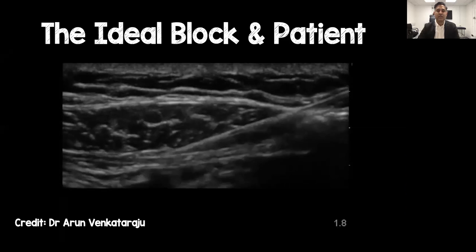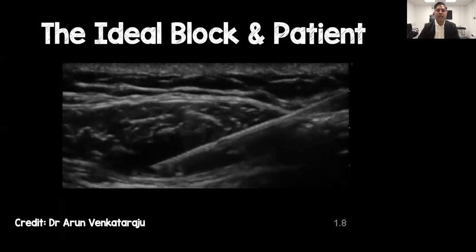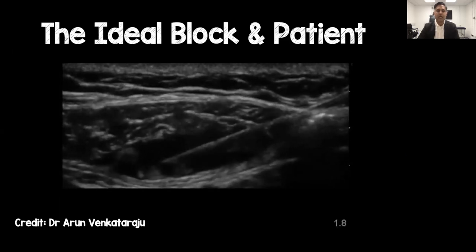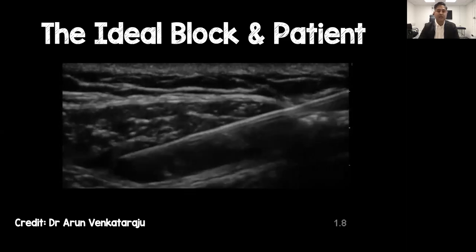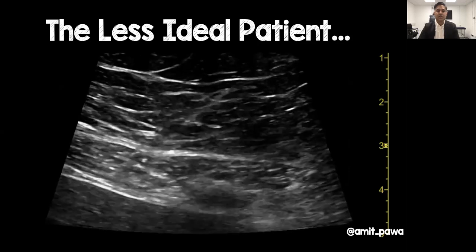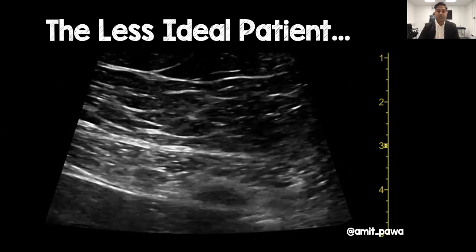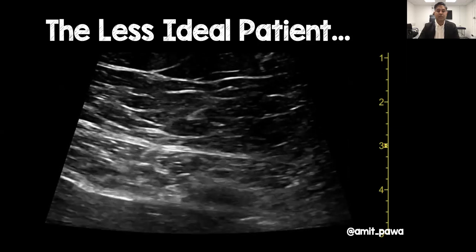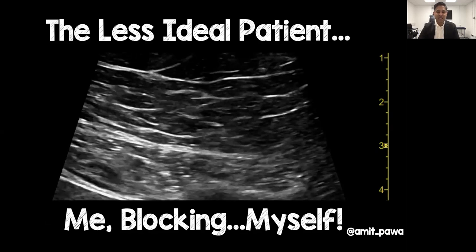What does a block look like in real life? Here's a skinny patient with a linear probe in-plane going through the muscle — look at that muscle lifting off the posterior rectus sheath, forming a beautiful lens-like opening of local anaesthetic deep to the needle. There are the epigastric vessels but look how that space opens up wonderfully. Now the same block in a less ideal, less skinny patient — a slightly steeper needle angle coming through the muscle substance — a test injection shows an intramuscular injection before advancing to find the posterior rectus sheath. That was tricky, mainly because that was me demonstrating the block on myself.